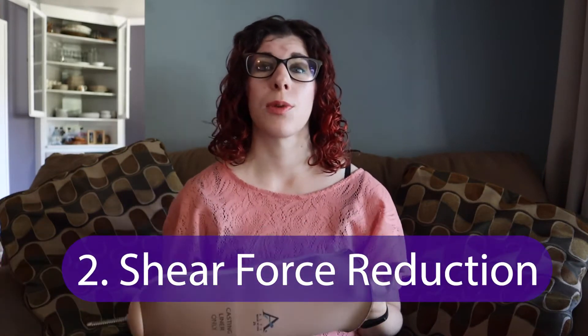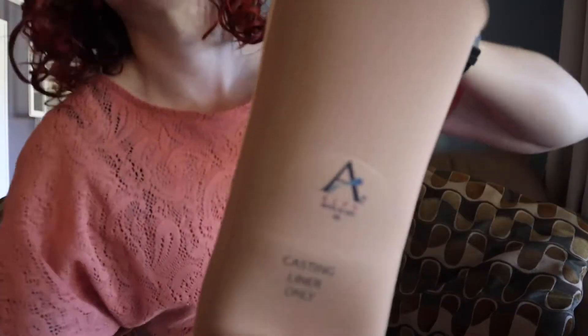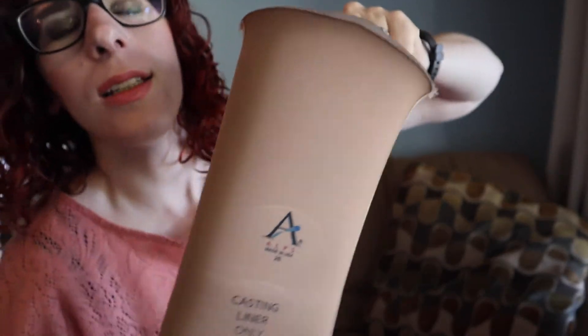You're also going to look at how it reduces shear forces. Some liners are a lot more tacky on the inside, giving increased friction that holds better on your limb, but that can cause shear forces especially with more delicate skin. Other liners are more slick and have less friction. You'll also look at elasticity — how much it stretches both longitudinally and circumferentially.